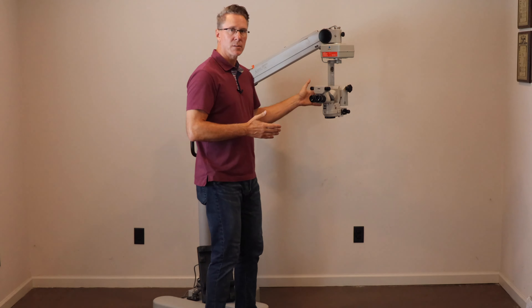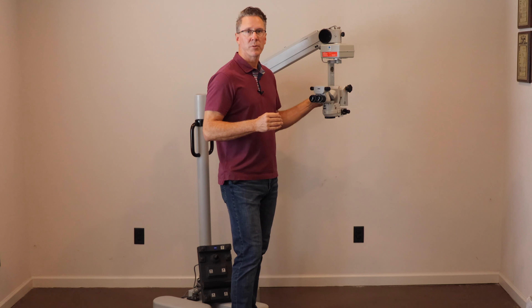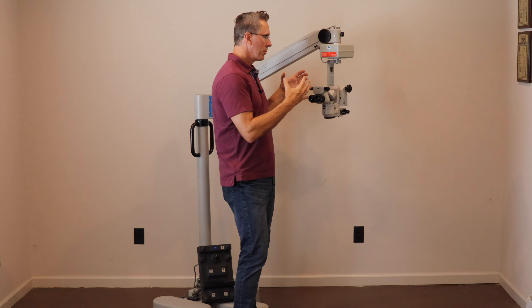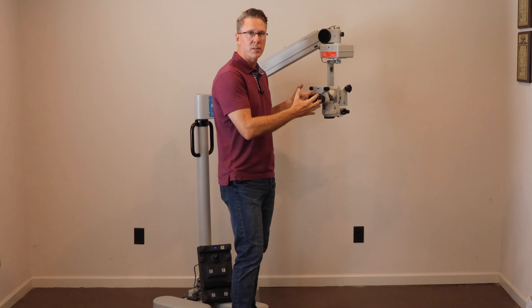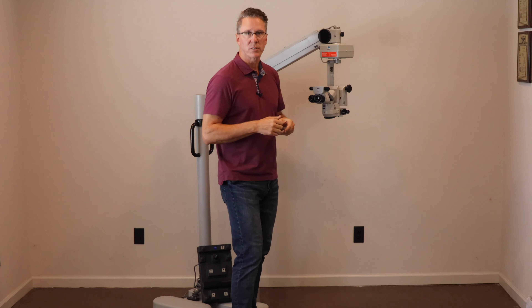The MDU optics are excellent. They do not have what I consider modern illumination for ophthalmology. The optical quality of the system is excellent, but it just does not give the amazing red reflex that the modern systems do.